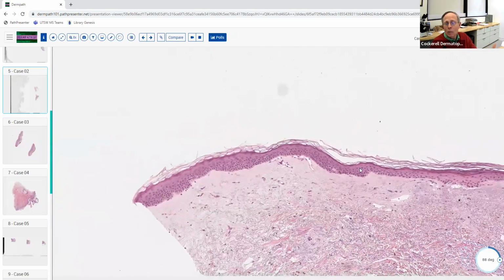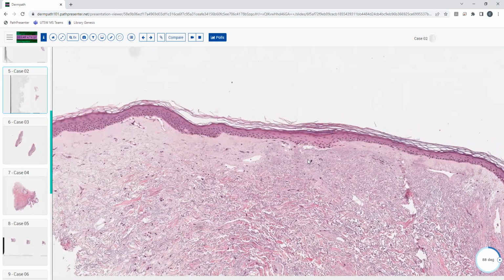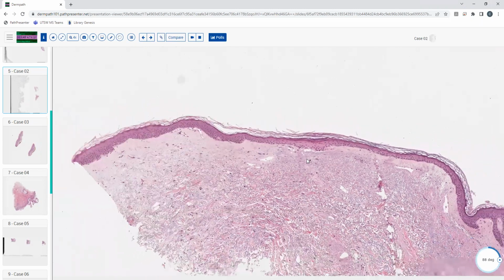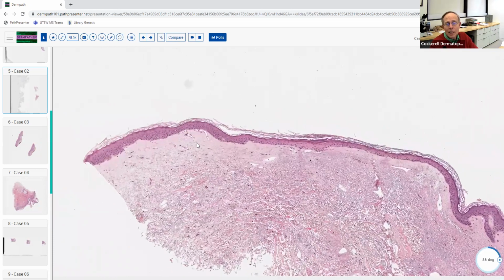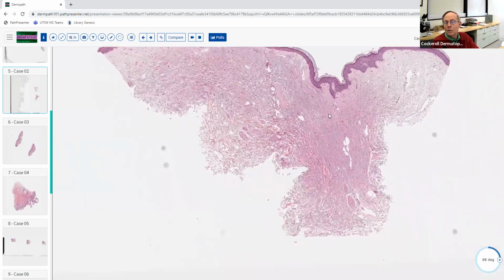And probably this patient may have had maybe a basal cell treated with radiation therapy, and then they thought maybe it recurred and they decided to take another biopsy or something. Usually to get this kind of change, it's not the kind of radiation that's used when you're radiating a deep, say, lung cancer. Those usually are electron beam and things like this that go deeper and they sort of spare the skin. So you don't get as much radiation damage usually in that situation. They can kind of dial it into the deeper areas. So anyway, this is a good example of that.